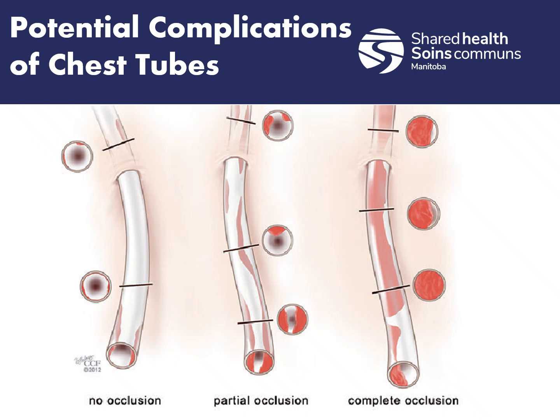That's not safe practice for us, because when we're doing all that manipulation of the tube, that can actually generate pressures inside the chest tube, which can affect the thoracic pressure in our patients. So really, we're not going to do that. If it gets clogged, we're just going to make note of it. If the patient starts developing pain, things like that, because let's say they're draining blood and it starts backing up into their chest and there's a big concern, we could always contact medical direction for direction, or we can just go to the closest open facility, but we're not going to be milking this tube or anything like that. But again, something to look for before you leave the facility.